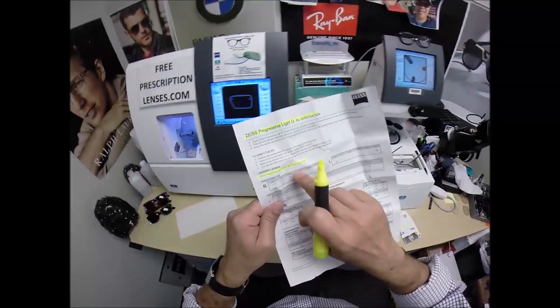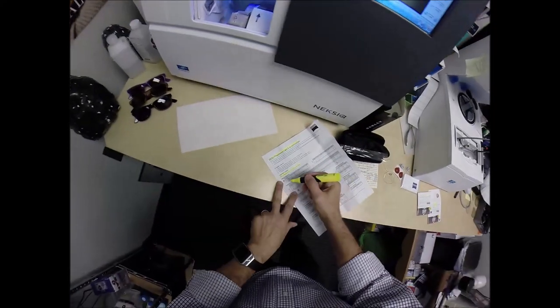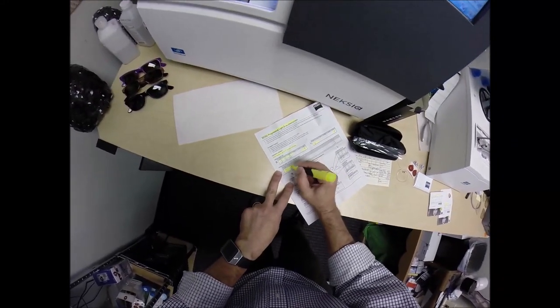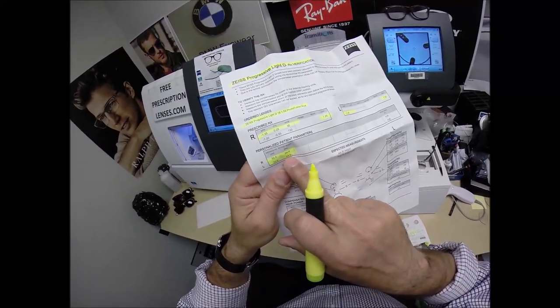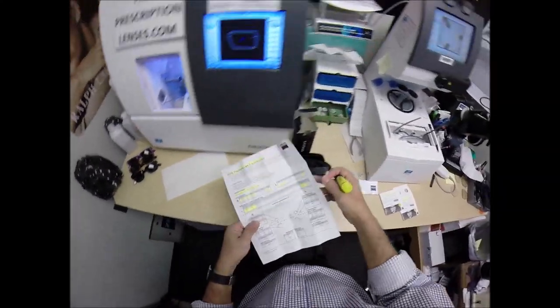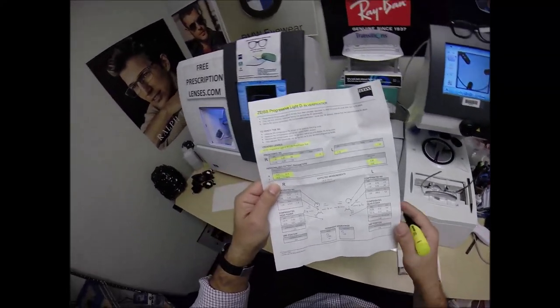Same thing but from before, the 1.59 refractive index Photofusion Blue. Here's the prescription for my right eye. Here's the prescription for my left eye. Here's my pupillary distance. The 24 is the optical center height of where it's going to sit directly in front of your pupil and the base curve of the lens. For people who are base curve sensitive, show this to your doctor and say, match this base curve, please.